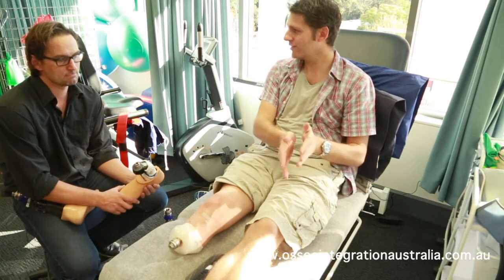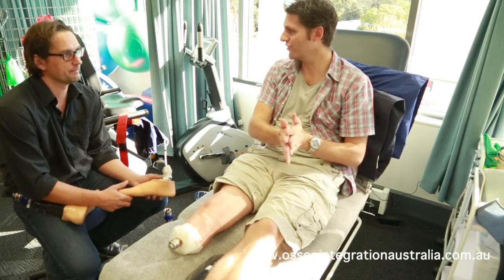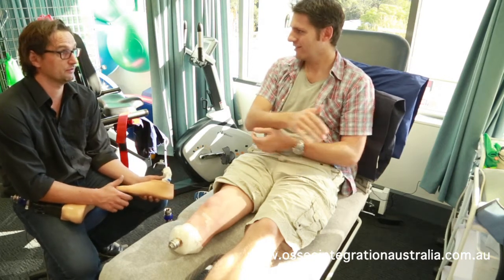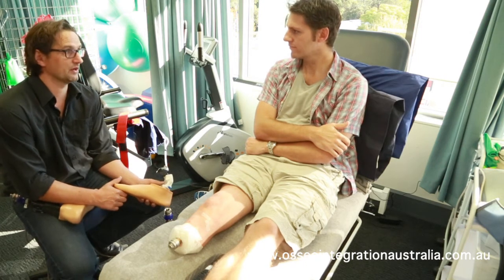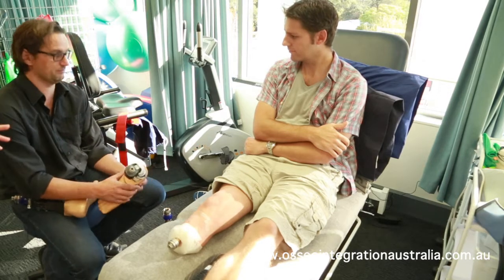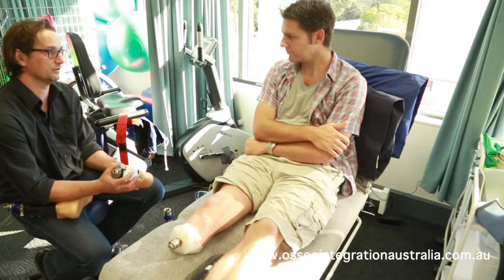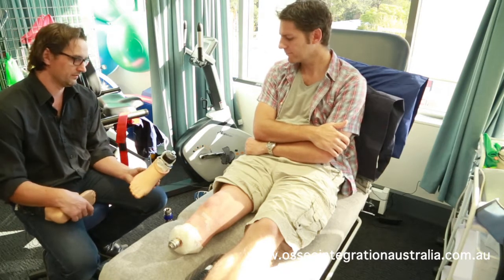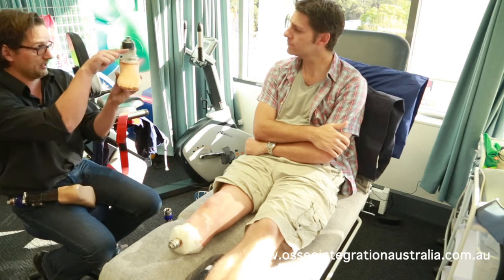I like the Reflex, because I like what it's going to offer me, but I also want a cosmesis. Maybe... For that particular foot? Well, I don't think you can put a cosmesis on a Reflex. It's really difficult to move. Try it a few times and it's going to squeak — it squeaks and it just cracks here really quickly. And it impedes what the foot can do, really. They are paying to cosmetically cover as well.